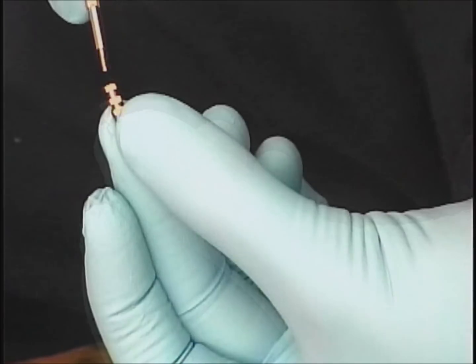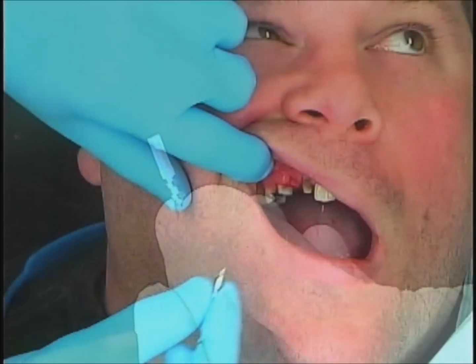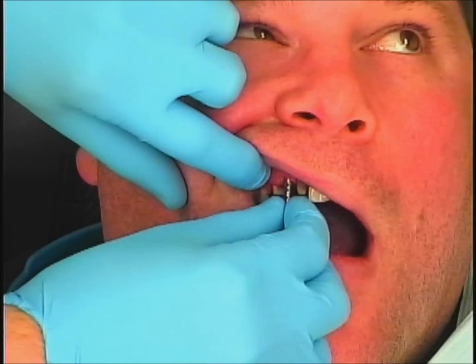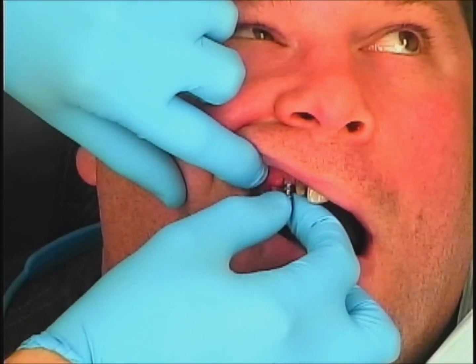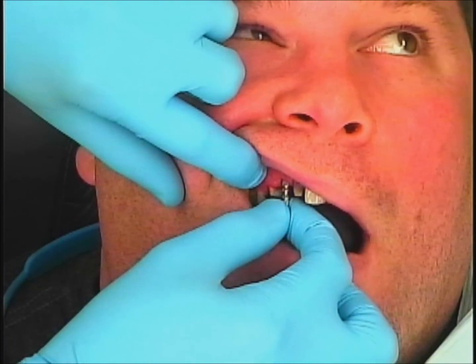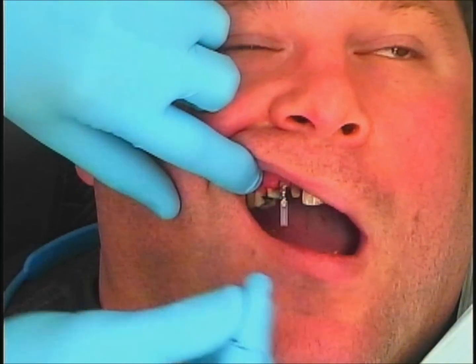So once I have that removed, I'm going to take the retentive element of my impression coping and insert a pin, which has a plastic tube on top. That really sticks up by a mile and really clears the open tray, which you'll see in a moment. So I take those two pieces, which make up my impression coping, and I'm rotating until I feel that fully seat. What I really like about this system is that component will only tighten down if it's fully seated. If it's not fully seated, it just spins around.